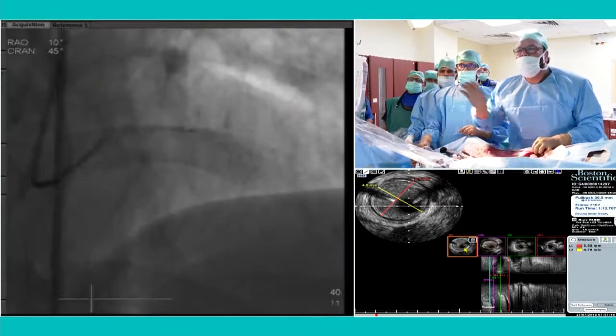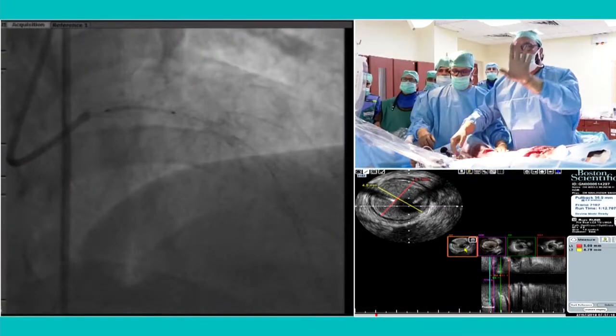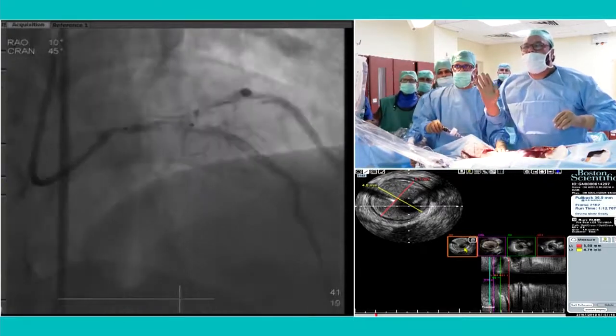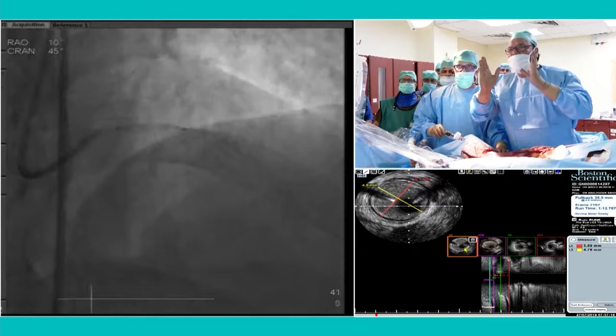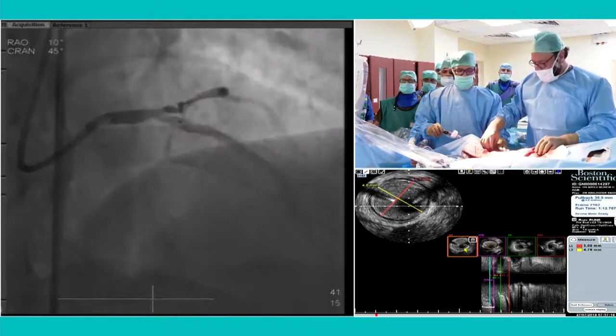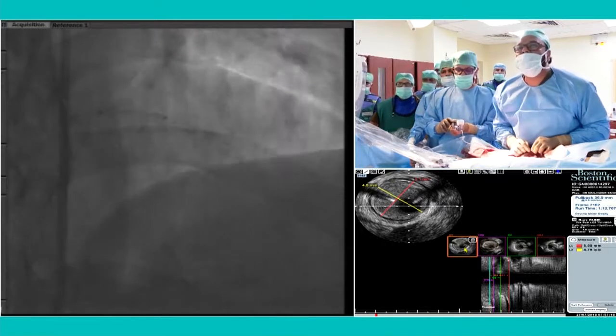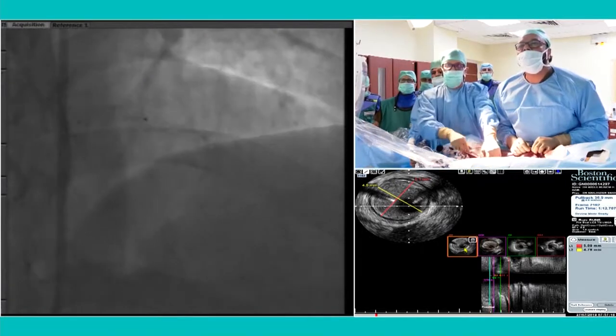I think you're good. Just give me a little bit. We have got 8 to 10 in the left main. Yes, it's an 18 stent. Half is 9, right? Go, deploy. Excellent. It's moved. Your question is actually, can you just ask the question?